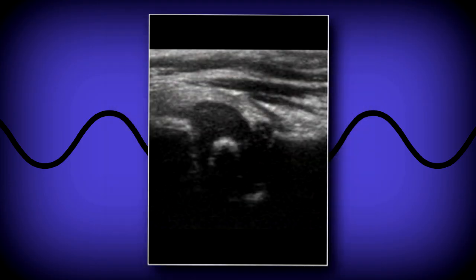When scanning older babies, you will often see an echogenic structure in the center of the femoral head. This is a normal structure — it's just the ossification center. As the baby gets older, the cartilaginous portion of the femoral head ossifies more and more.